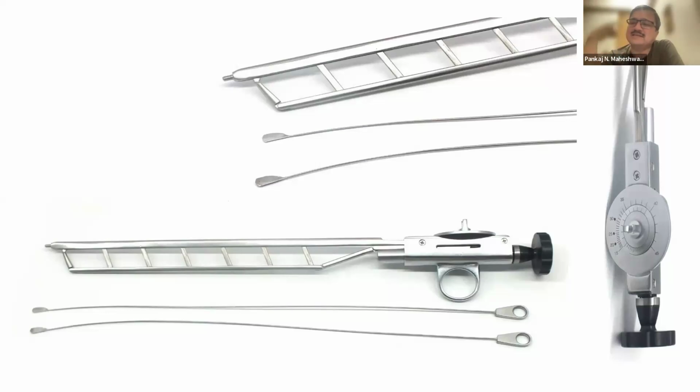Why did you specifically say straight? Is there a curved Otis also? Curved Otis urethrotome is also available, but it is not predominantly used, sir. Okay, I have not seen it, so I'm not aware of it. I have also not seen. To the best of my knowledge, it is available only as a straight urethrotome. And frankly, even logically, I would feel that there is no need for a curved urethrotome, because you are going in a straight tubular lumen. I don't know where you would use a curved urethrotome.